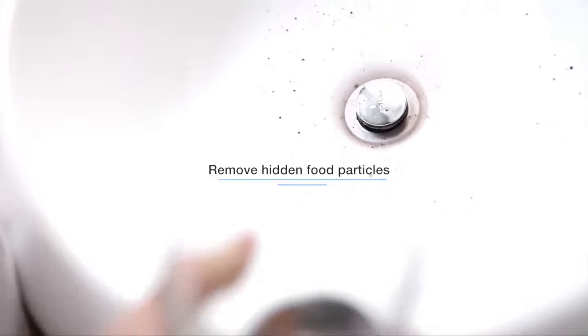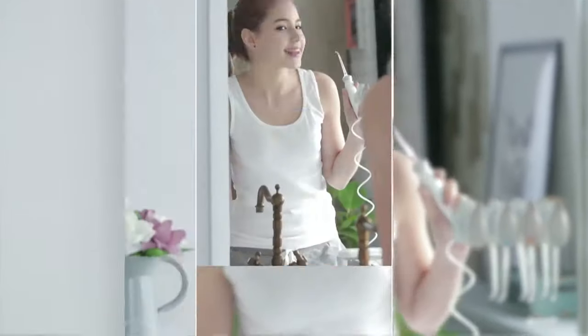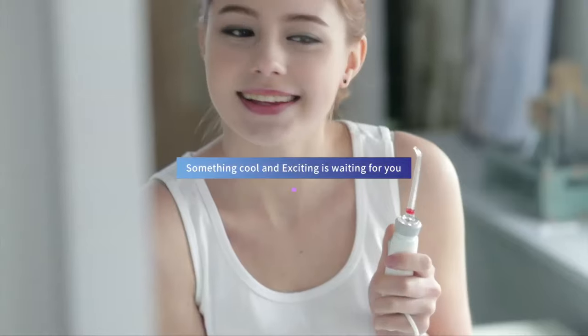Normal brushing and flossing cannot remove all the hidden food residues hidden within your mouth. But with Aquapik, you can. Your teeth — something new and exciting is waiting for you. Aquapik.